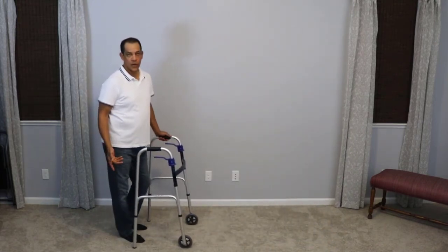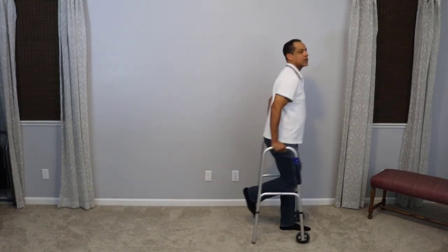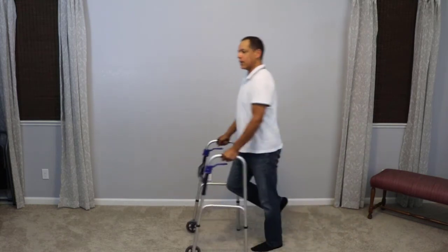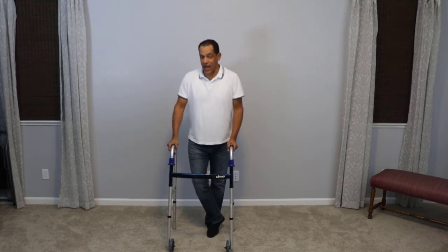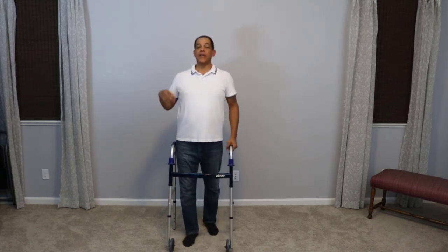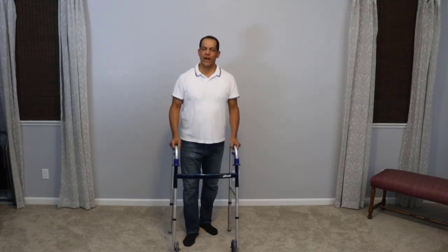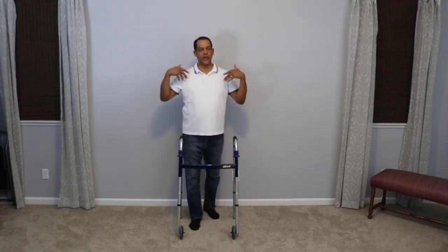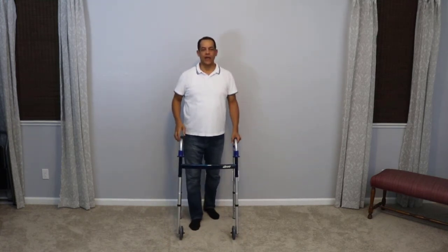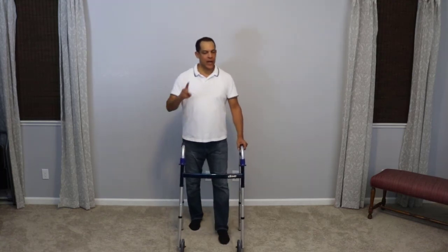That's a little different than what most people think of when using a walker on one leg — they typically hop around. Hopping takes a lot more energy, you can tell by my voice. It makes you a lot less stable, and for whatever reason, unconsciously it tends to increase your anxiety level — like you're in a hurry, you have to do something before you fall, or you have to get to your destination quickly.